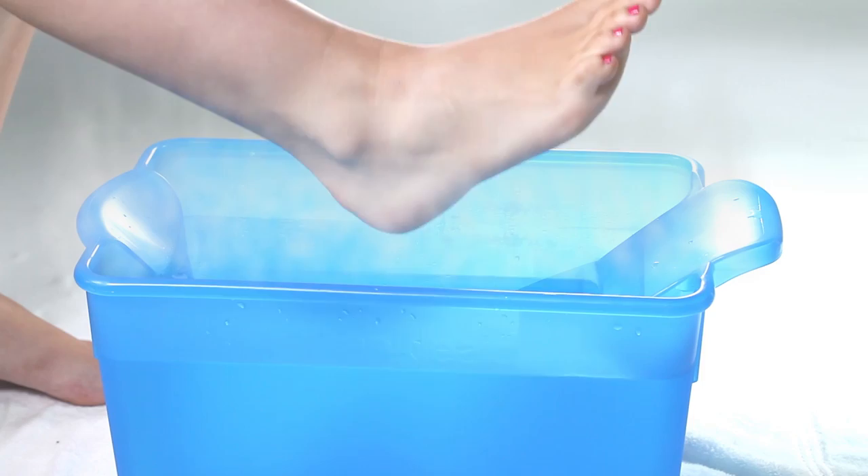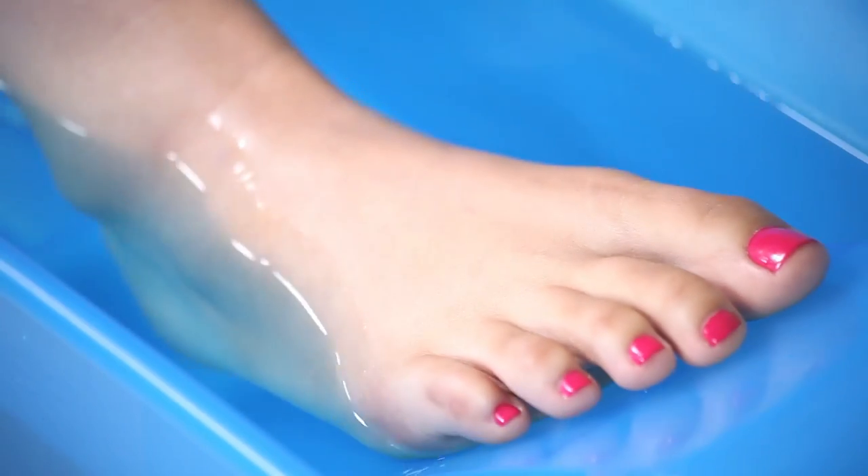Insert your bare foot into the water. Oh, carefully, my dear. If it's too hot, add some cooler water. There, that's nice.